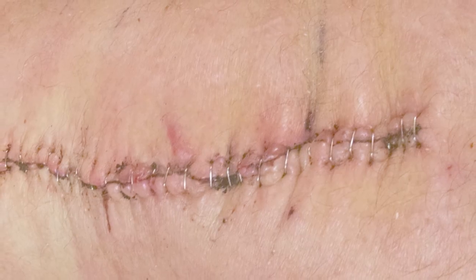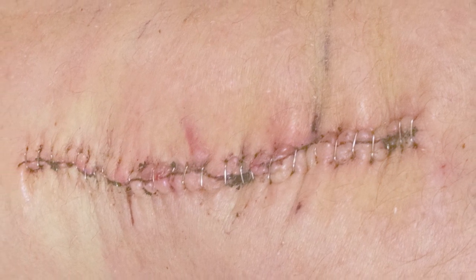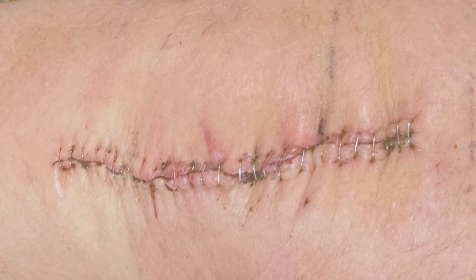Wound infection is one common complication of wound closure, and the risk with staples was found to be higher than sutures when both methods were compared in one review of almost 700 orthopedic cases. This could relate to how quickly and easily staple closure is to perform — so easy, in fact, that you may be tempted to always use staples. If you're not careful to clean the wound and eliminate dead space, however, you might lock in bacteria that could cause real trouble. It's always important to consider the factors originally causing the injury that may lead to infection. Just as with sutures, staples can cause scarring. Healthcare professionals should not use staples on the face or neck, and discomfort may make them a less popular choice for the hands or feet.